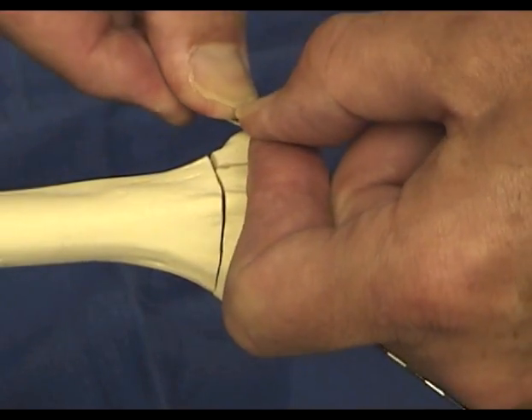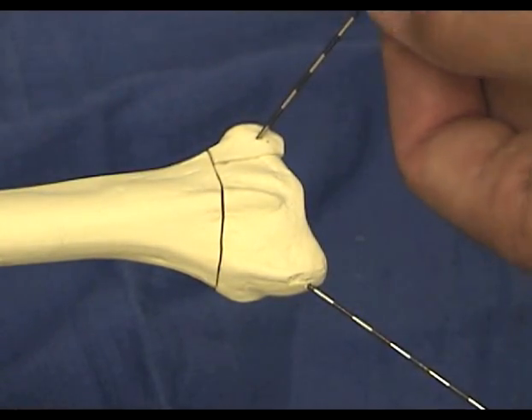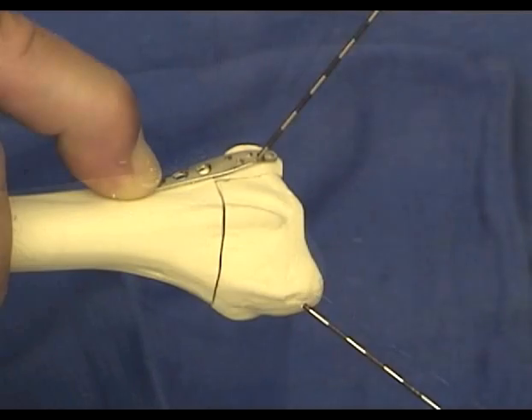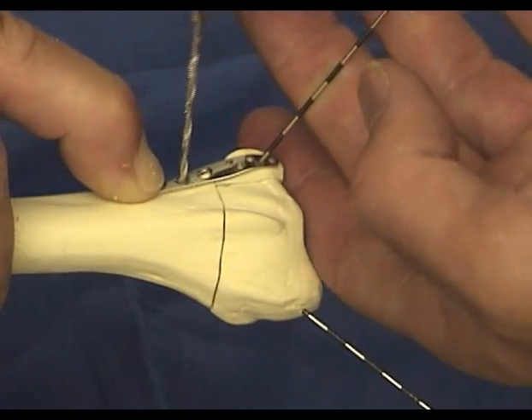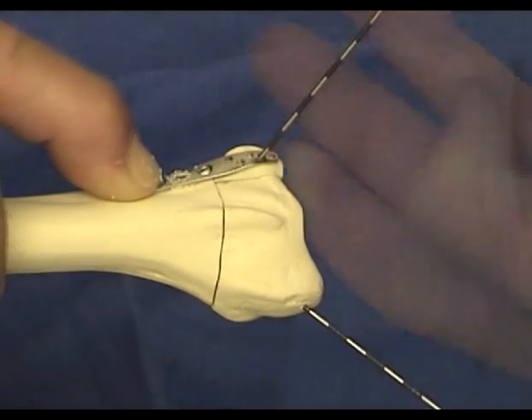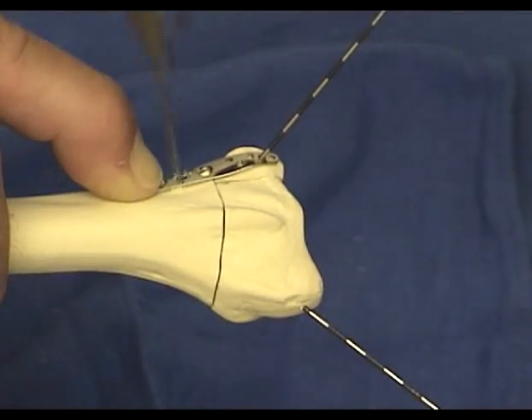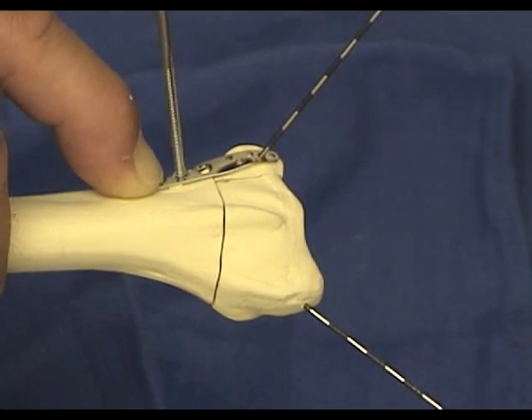Occasionally, a slight amount of extension can be added simply by bending the plate by hand. The plate is then slid over the pin, pulled proximally, and secured initially with a single screw. In hard cortical bone, it is often easier to tap the proximal cortex in order to simplify insertion of the bone screw.